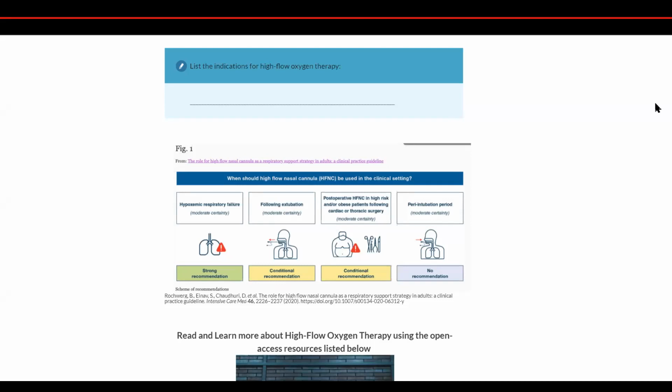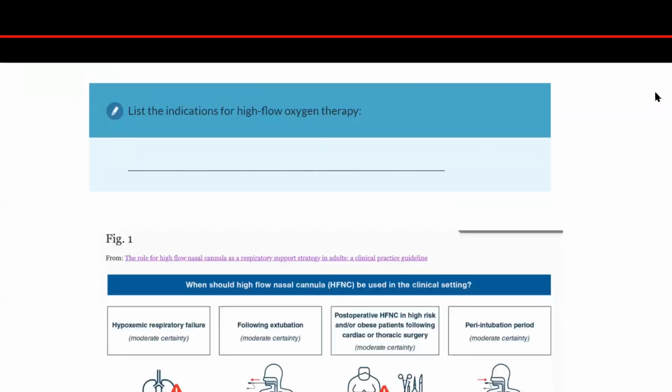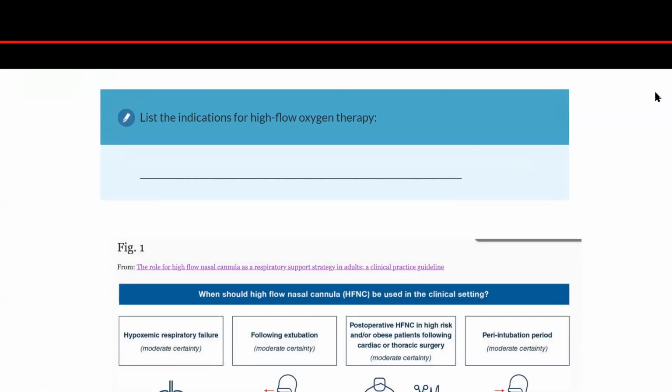but we are not doing most of these surgeries in our context. And in the peri-intubation period, what I have seen is pre-oxygenation with high flow can prolong the time of apnea. I think this last one is interesting to most of us during anesthesia. So sometimes you may have an obese patient undergoing bariatric surgery who has 150 kilograms or 200, and then you need to maximize the time of apnea during intubation. This will be a good use of high flow therapy in our context of anesthesia.